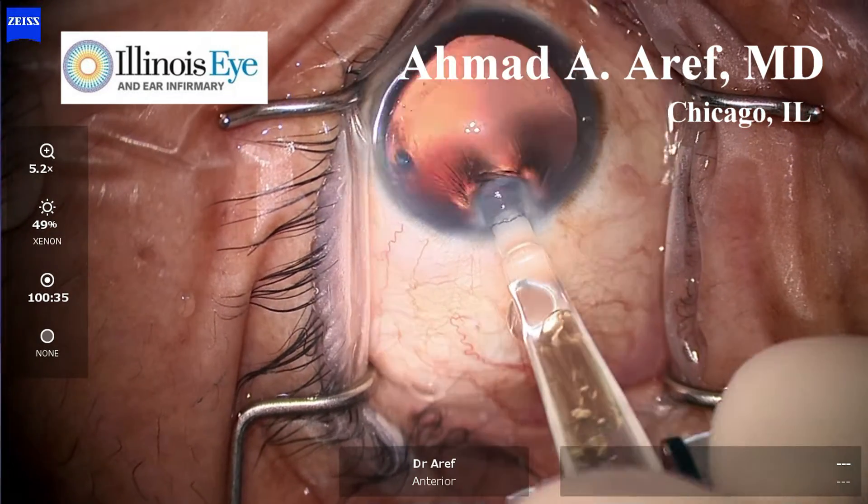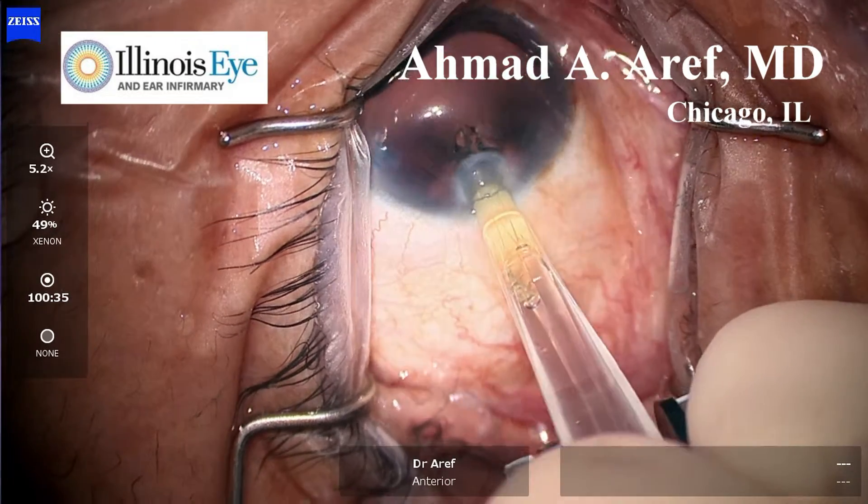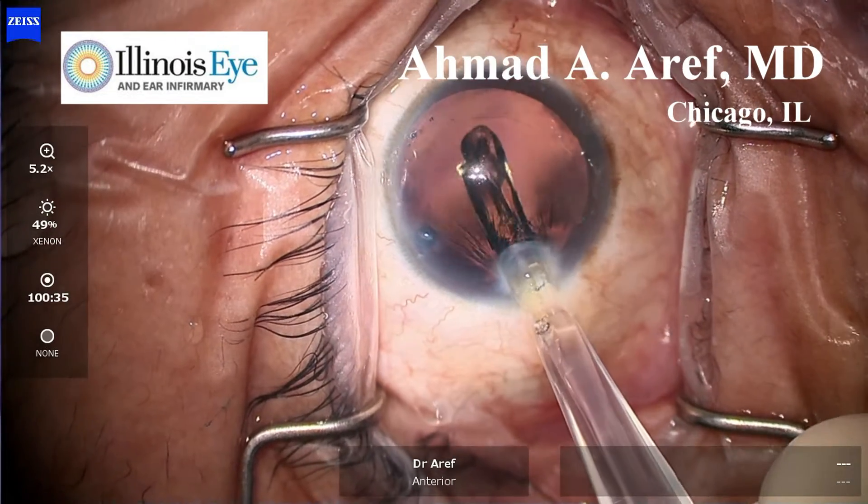After filling with balanced salt solution, one should leave the intraocular lens for about 3 minutes before implanting in standard fashion.